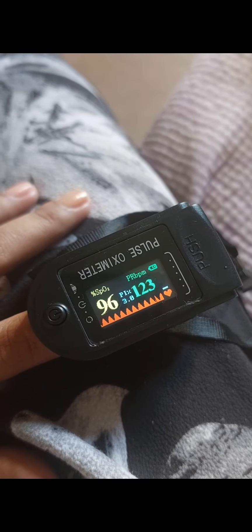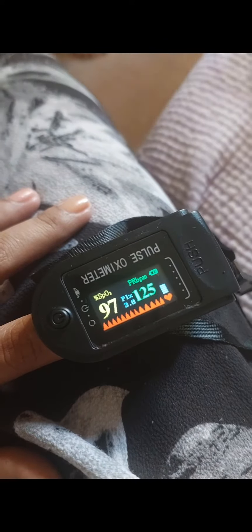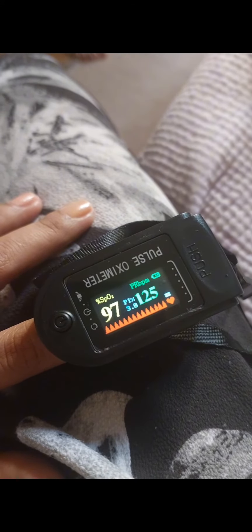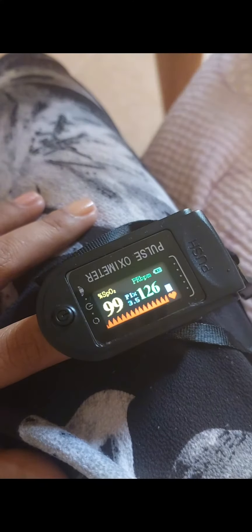I took this video during a palpitation, and as you can see, I exceeded the 90 beats per minute — it's already 125, and it scares me a lot. Just relax and do the breathing exercise.